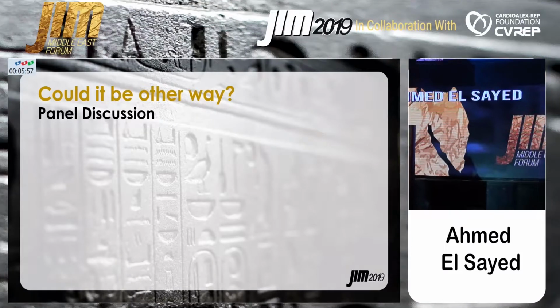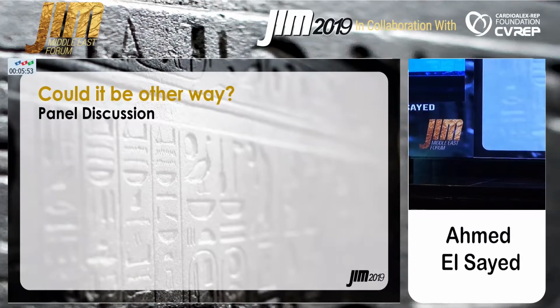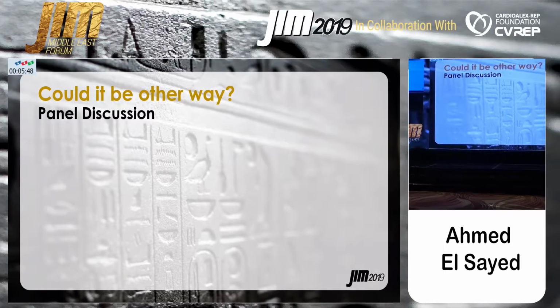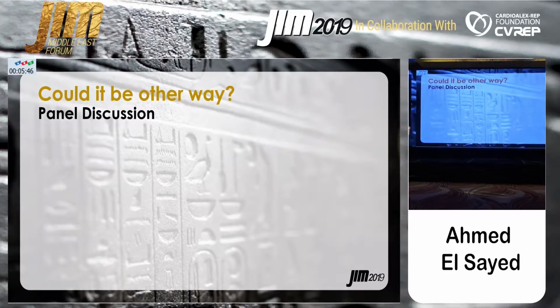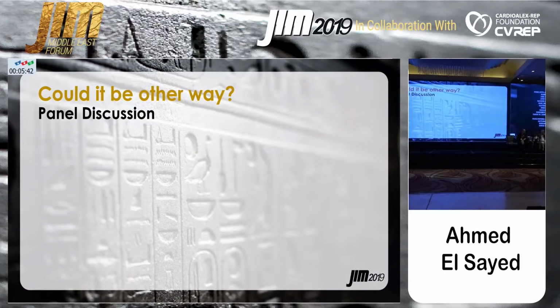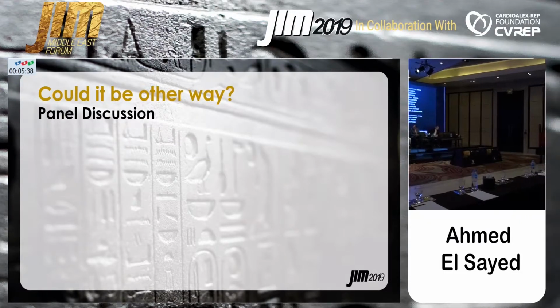Why did you need a wire in the right coronary during deployment of the valve? The new technique nowadays is putting a wire in the coronary while you deploy.